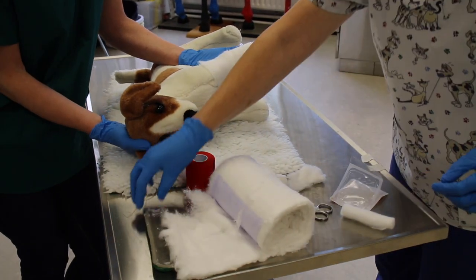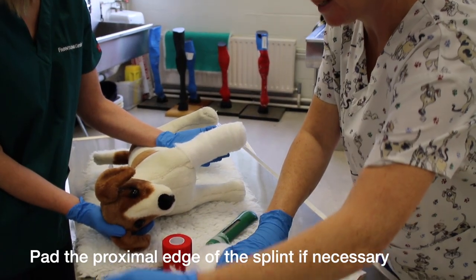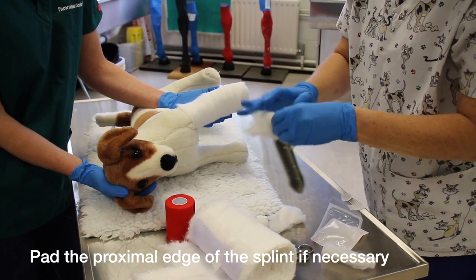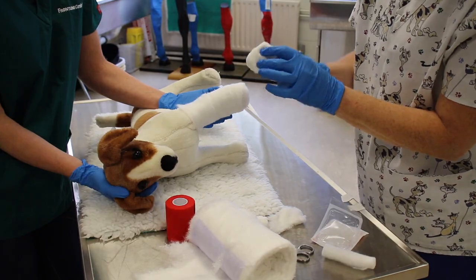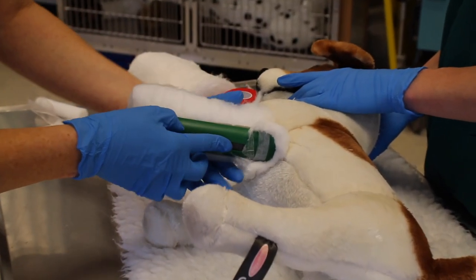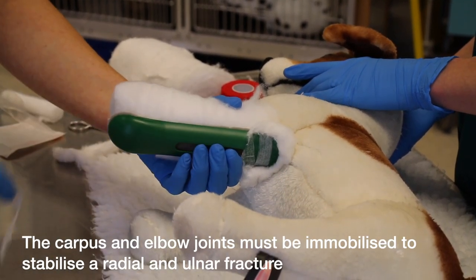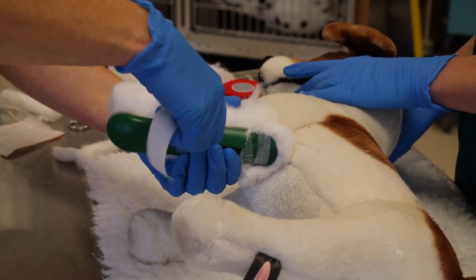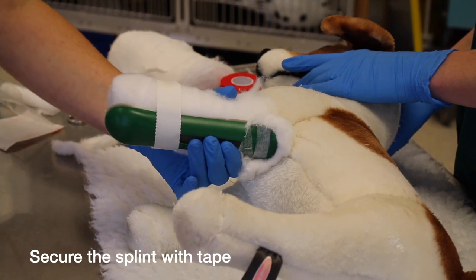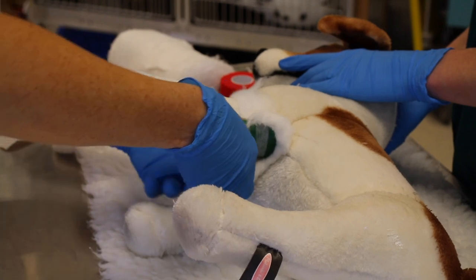Now we are going to place our splint. You need to check your splint — if it has sharp edges, you're going to put a little bit more padding over the top of the splint. Don't put it in at the end, because then your bandage gets very tight. Place the splint on the caudal aspect of the limb, making sure it incorporates the carpus and the elbow so that the leg is immobile. Then hold it in place with our two strips of tape. Be careful that you don't put them on too tight and cause an area of pressure within the bandage.